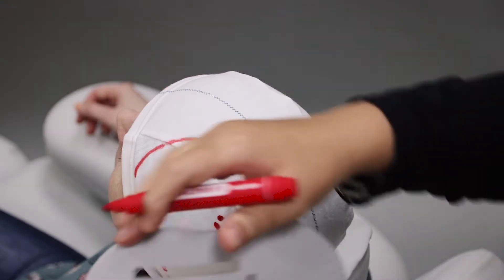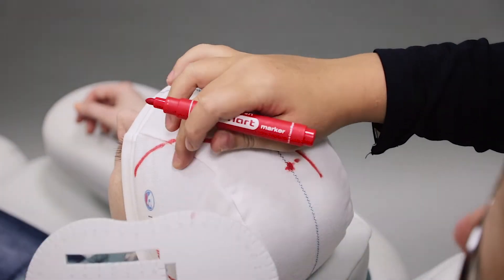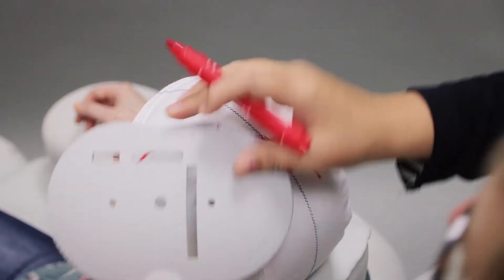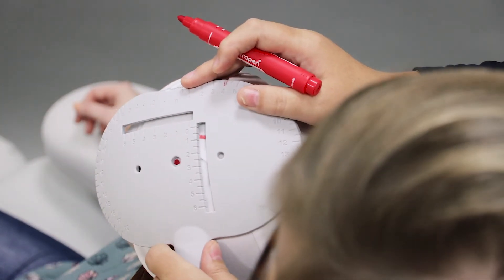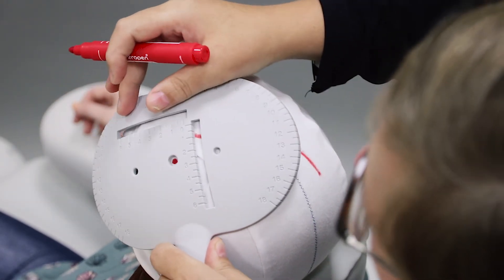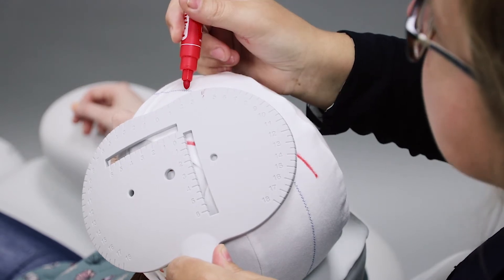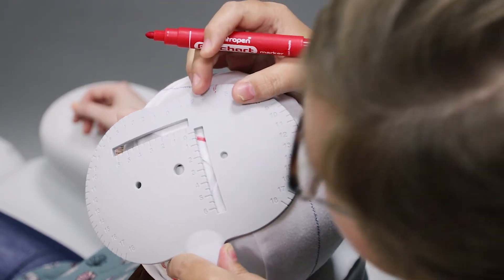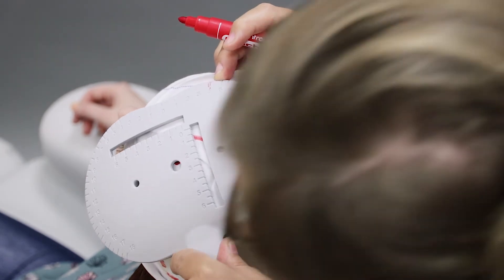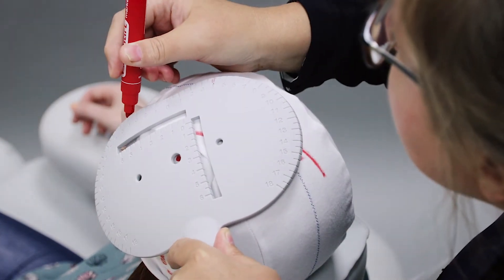I place the coil positioning tool on this new point so I can see it through the hole, and rotate the coil positioning tool until I can see the number 4 on the sagittal line. This is the correct positioning, and I draw the line.